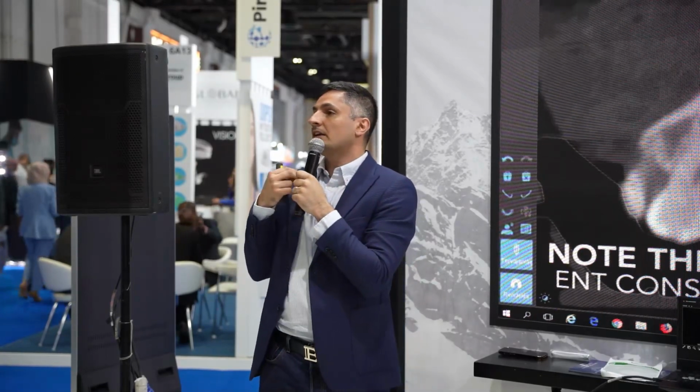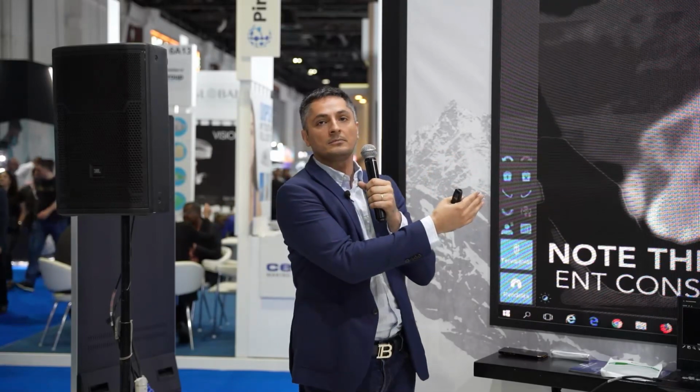So release it from the crest. Don't be afraid. You will have good primary stability from the lower part. Try it. Yes, very aggressive. Aggressive implants for me are used for extraction and immediate implantation. I don't use them for D1 bone in the mandible. This is a nightmare. This is very bad.